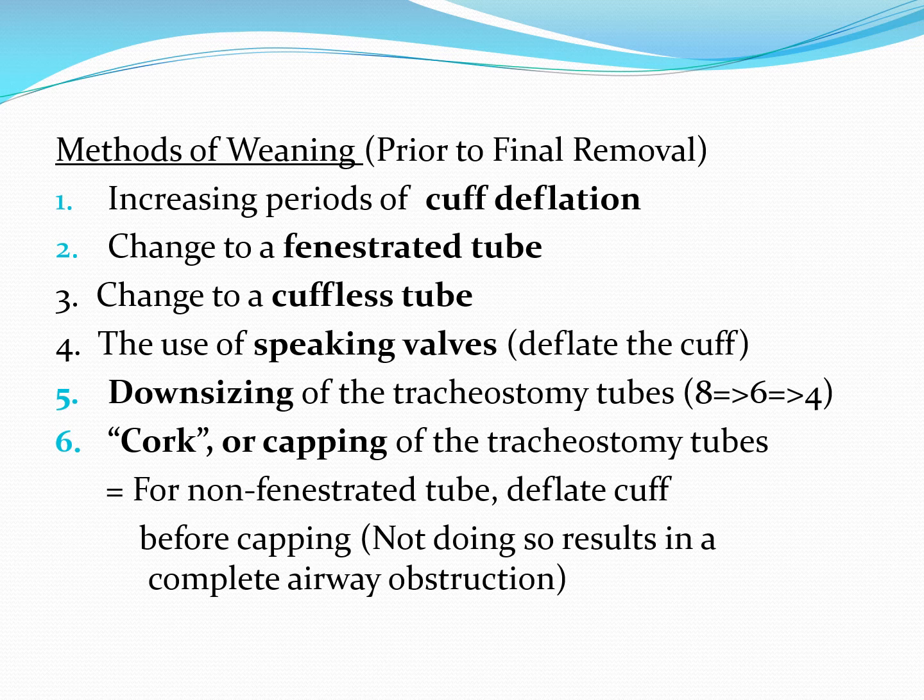Now, while there's a variety of protocols out there for weaning tracheostomy tube patients to decannulation, these are some basic principles that exist in essentially all or many of these protocols.